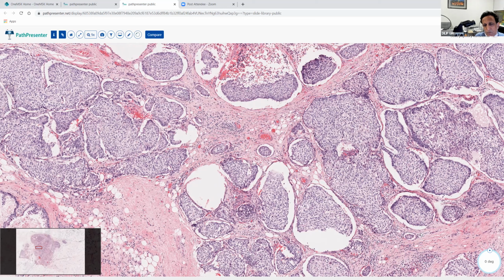But if you see a good myoepithelial layer, it's best that you should not just push ahead anyway and call it invasive. Maybe if it still looks funny to you and you still think that maybe there is some invasion, it's probably best to let a breast pathologist take a look and weigh in on that. Right. Got it. Thank you.